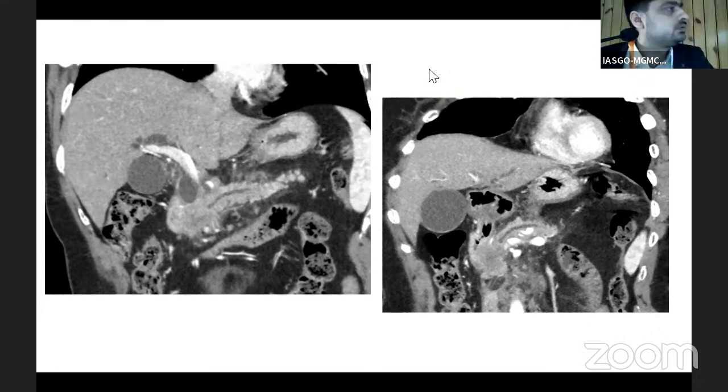The thing is, like what was said, for undilated PTBDs you need an expert radiologist because there's a chance of a lot of artery injuries and portal vein injuries. Anyone can do it in a dilated system, but if you really have an undilated one, in the city there will probably be only one or two experts you can call. So it's not easy.